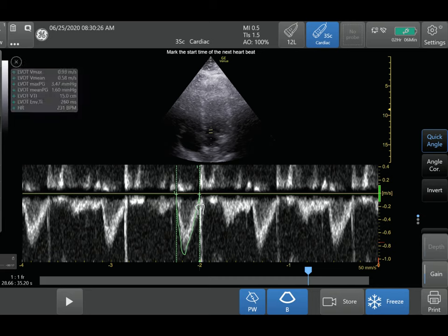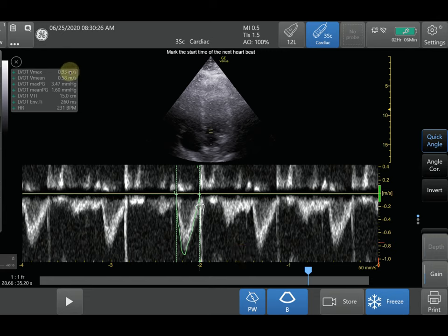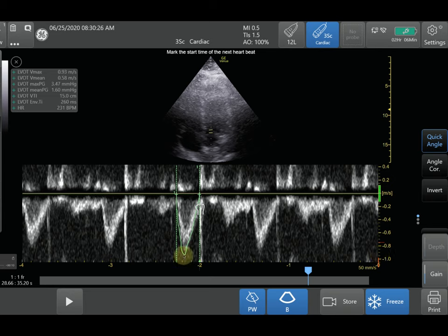After you're done tracing, the measurement will appear in the top left of your screen. For this specific application, the velocity time integral is 15 centimeters. That's the basics of how to use Pulse Wave Doppler — you can use it for many things. Sometimes you don't need to trace the whole waveform; you can just measure the maximum velocity. Here it also gives a maximum velocity of 93 centimeters per second, or 0.93 meters per second, which corresponds to the peak of the tracing. Often we just need the maximum velocity, but you can also get a full tracing of the waveform as shown in this example.